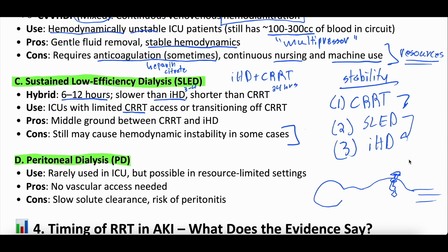And what you do is you instill fluid, special dialysis fluid, and you instill it so it goes into their abdominal cavity and it sits in there. And it actually creates concentration gradients across the intestines and things and helps filter the blood that way. And then after a certain period of time, you drain all that fluid out, and it gets rid of all the solute and stuff that has diffused into the intra-abdominal cavity and that fluid you put in there. So it's really interesting. A lot of patients do it because you can do it at home. You can do it while you're sleeping.